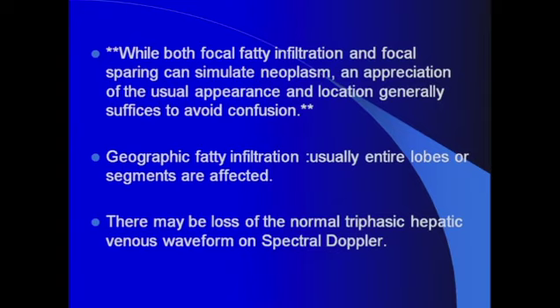One important thing that may help you supplement your confidence and sensitivity for diagnosis of early fatty infiltration of the liver is the use of spectral Doppler evaluation in the hepatic veins. So normally you should expect to see a triphasic hepatic waveform, which is a representation of opening, closing of the tricuspid valve and the atrial contraction.